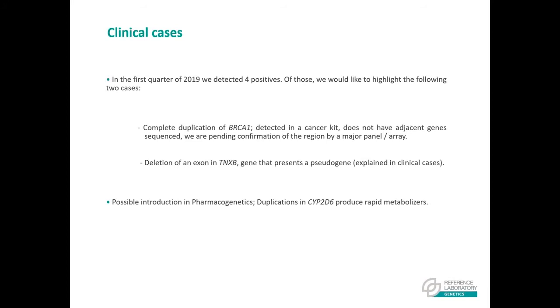The last relevant variant that I wanted to comment on is a deletion in the TNXB gene, which has great homology with the TNXA gene. This case will be discussed later in more detail. To finish this data introduction, I would like to advance one of the possible areas in which we will start working, once we collect all the necessary information and validate it.